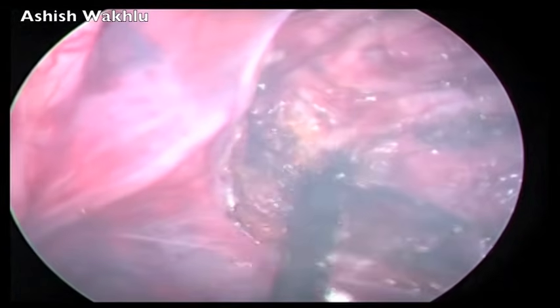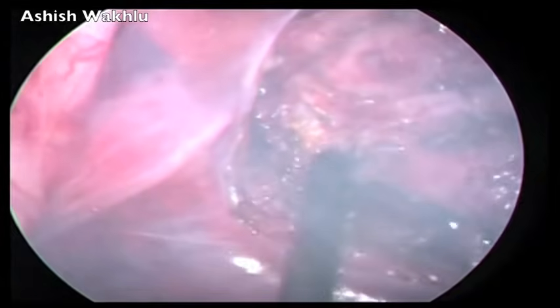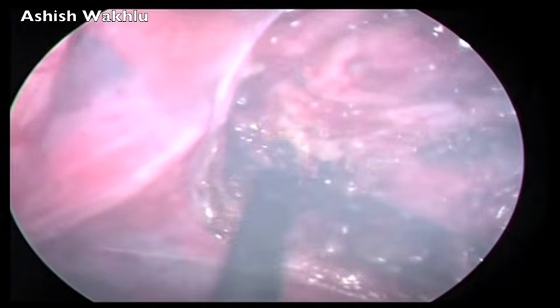Even though the fistula seems quite large from the outside, once you actually begin to divide it, quite a lot of tissue gets divided on all sides before you reach the rectal wall and open the lumen.